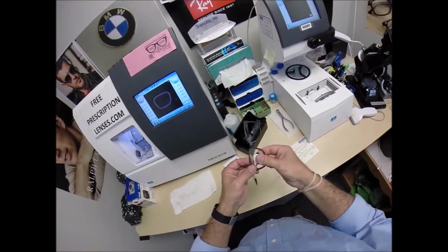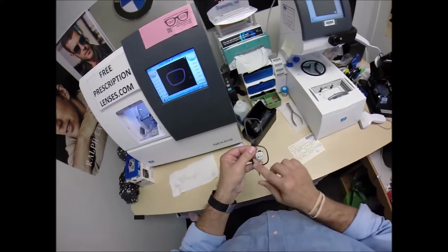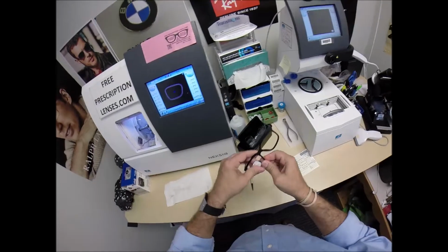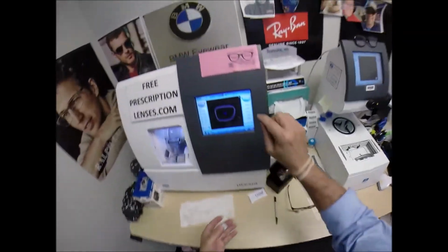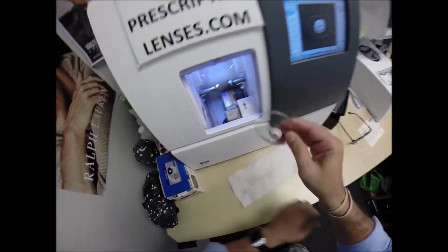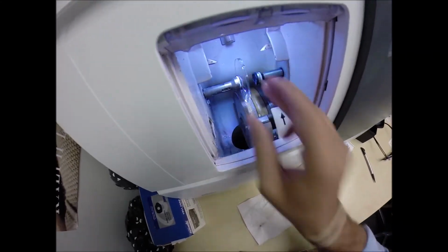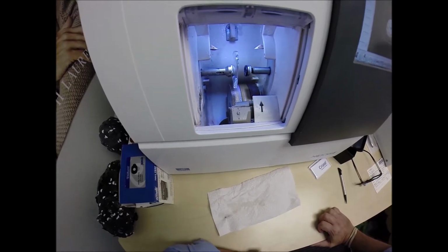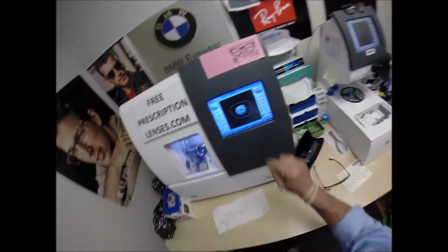So I'm going to tuck this in at the outside corner. And this is the outside corner. Use my thumbs, press down at the nose, and it snaps right in. Let's go ahead and start doing the left lens. We're going to flip that over to L. Press the block on there firmly. Attach the magnet to the Chuck, the Charles, the Chucky baby, or today I will call it the Karen. Hit the green start button.